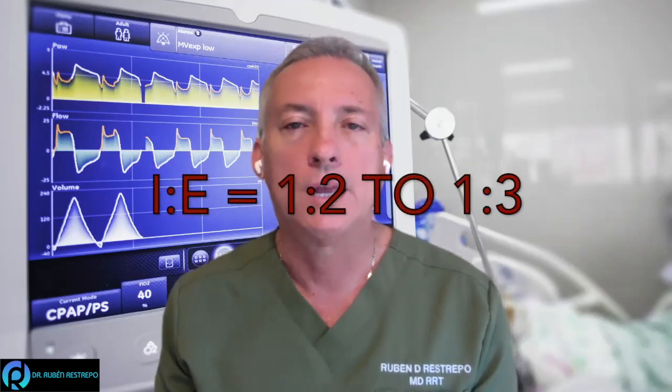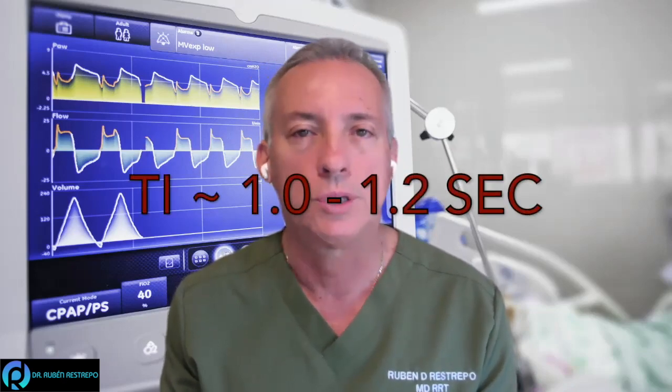PEEP, it is extremely important that you remember something. While you may be focused on setting the IE ratio to the ideal 1 to 2, depending on the frequency you use, you may end up with an inspiratory time that is not adequate for the ICU. You may end up with an inspiratory time of 1.4, saying that yes, it is 1 to 2. But the practical point is that in the ICU, the adult inspiratory time is going to be around 1 to 1.2 seconds.